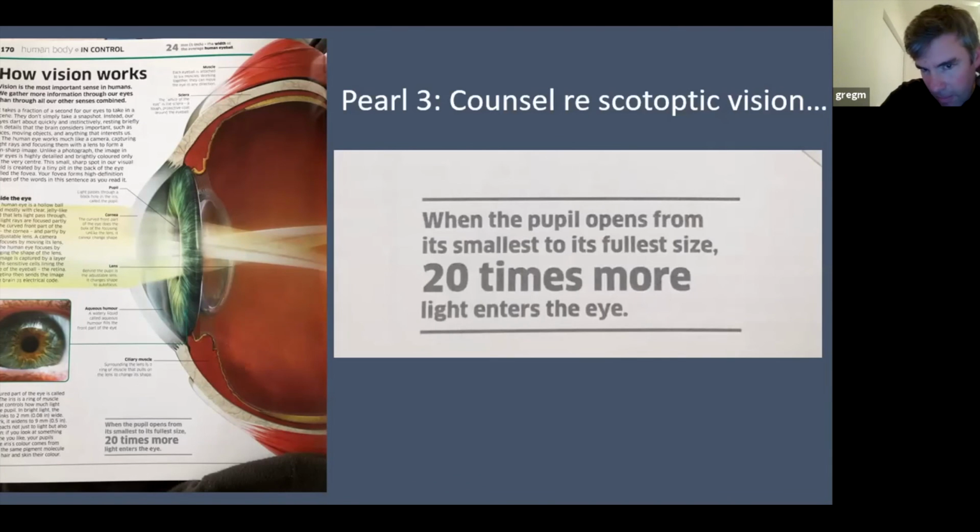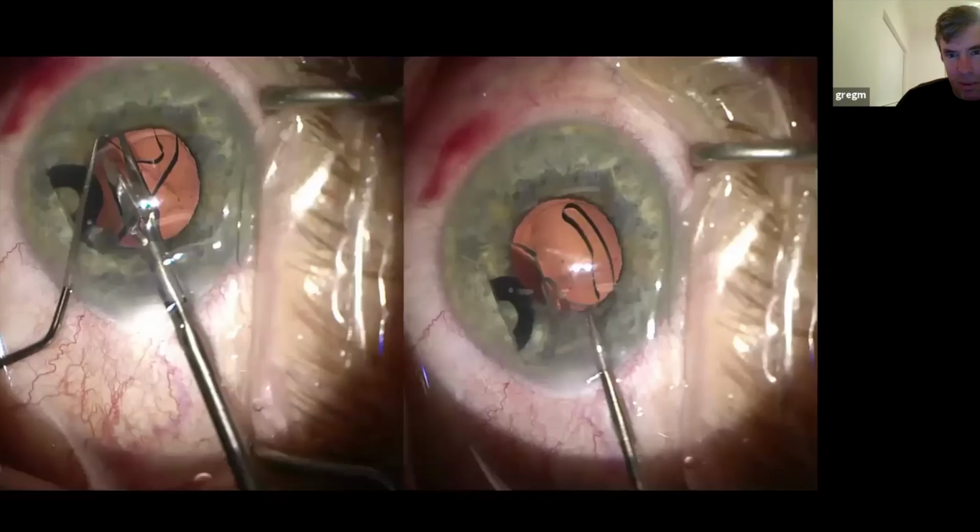With some of the early visual results I was getting with the IC8, I became very impressed and was very excited by some of the visions we were recording. In one or two early patients, actually with bilateral keratoconus, I implanted bilateral lenses. What I found in that one patient was it was just too much for him to tolerate the reduction in contrast sensitivity and brightness at night. And this is what happened to that lens in the second eye that got implanted. It came out again. So in my practice, it remains a unilateral option.